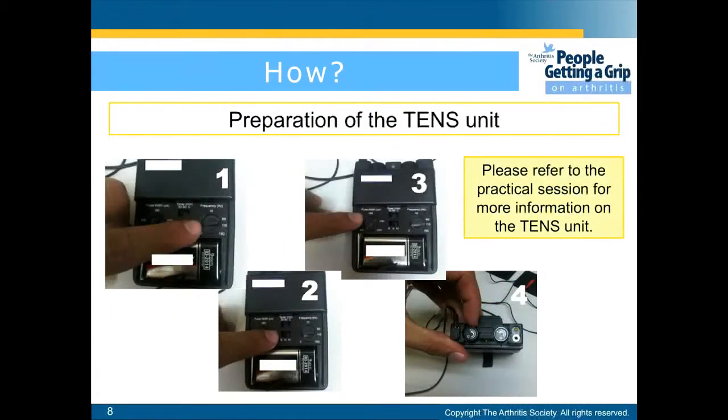To set up the TENS unit, firstly adjust the frequency, then the mode, then the pulse, and finally increase the intensity.